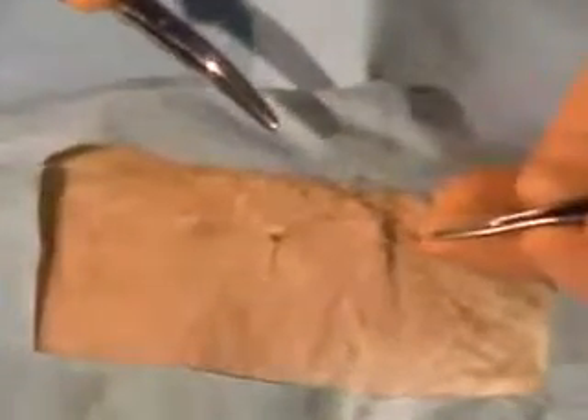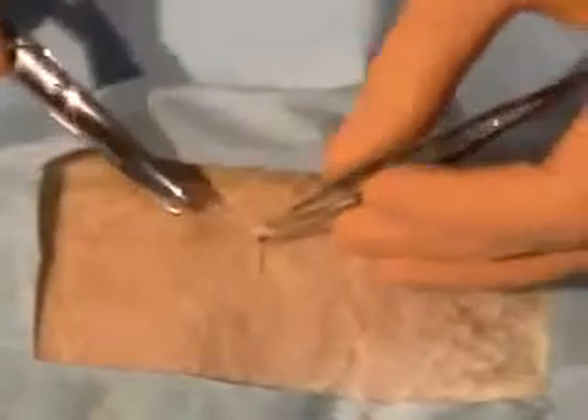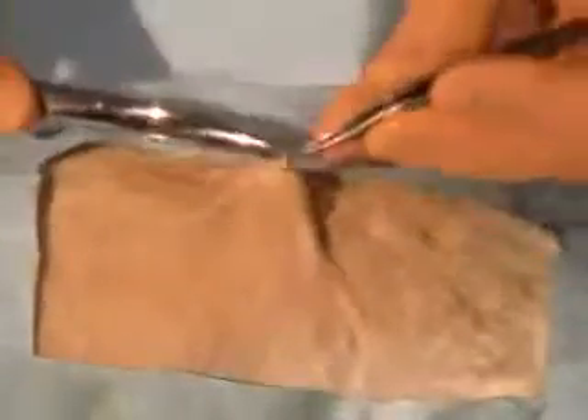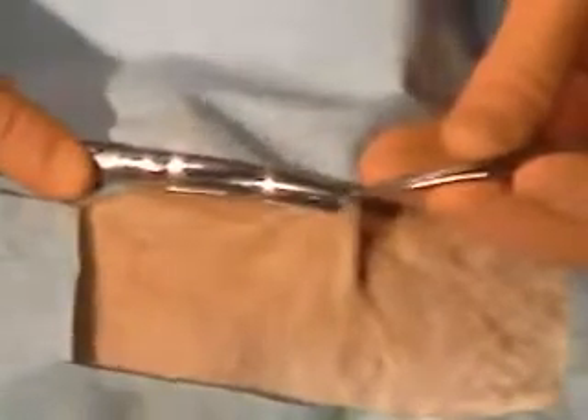So you just want to cut one of the limbs — a finer scissor in this situation would help. This is a vertical mattress stitch and you want to pull out the whole stitch. Usually the piece you take out should be longer than the two ends. That's a good way to know that you're getting all the stitch out.